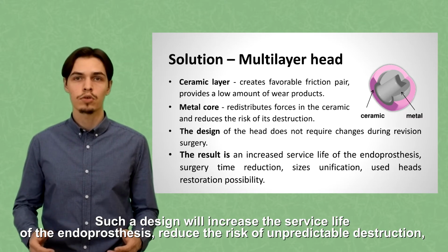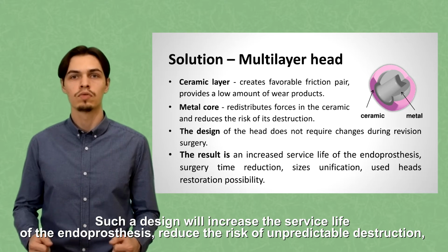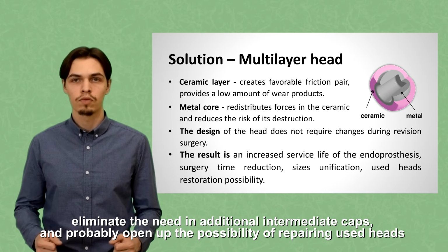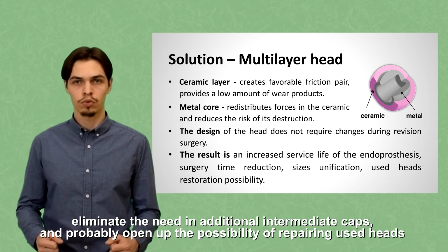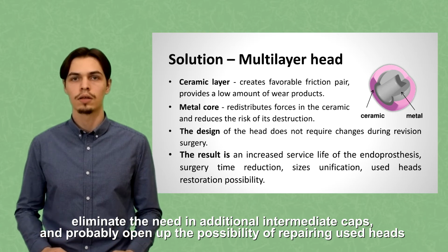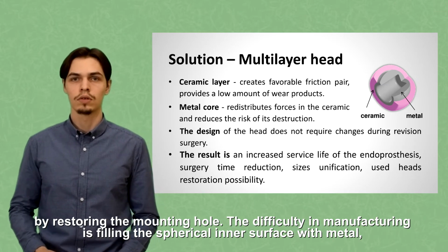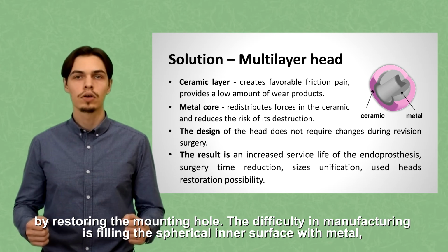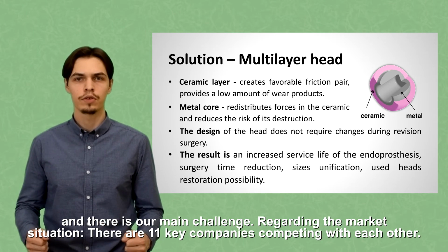Such a design will increase the service life of the endoprosthesis, reduce the risk of unpredictable destruction, eliminate the need in additional intermediate caps, and probably open up the possibility of repairing used heads by restoring the mounting hole. The difficulty in manufacturing is filling the spherical inner surface with metal, and there is our main challenge.